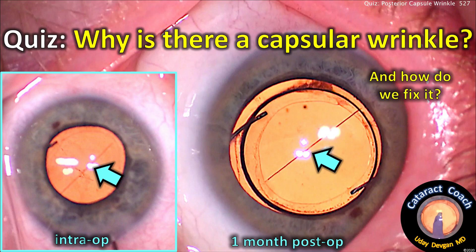CataractCoach.com Quiz: Why is there a capsular wrinkle, and how do we fix it?